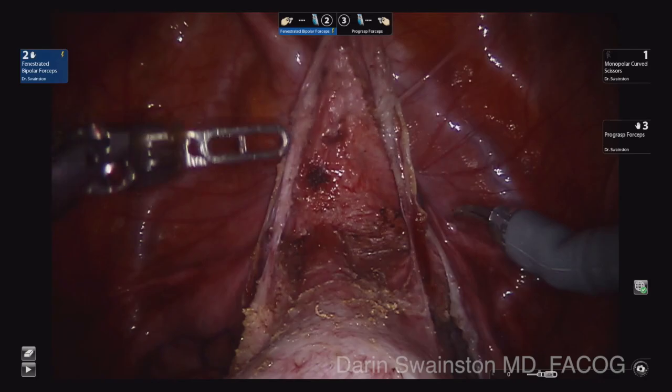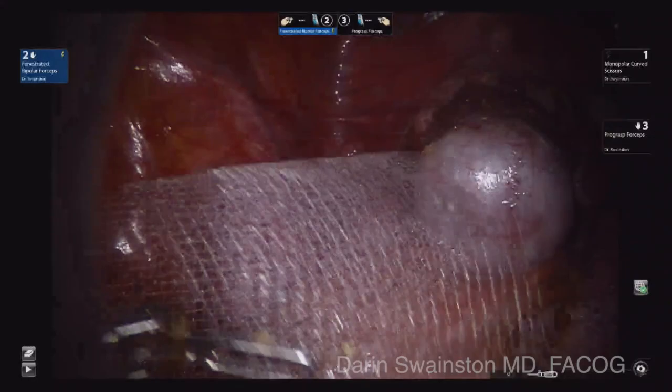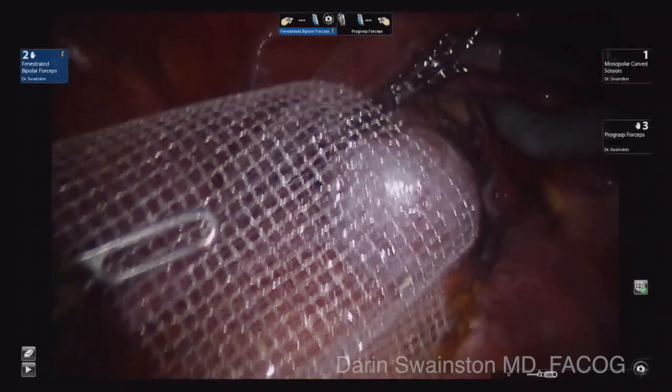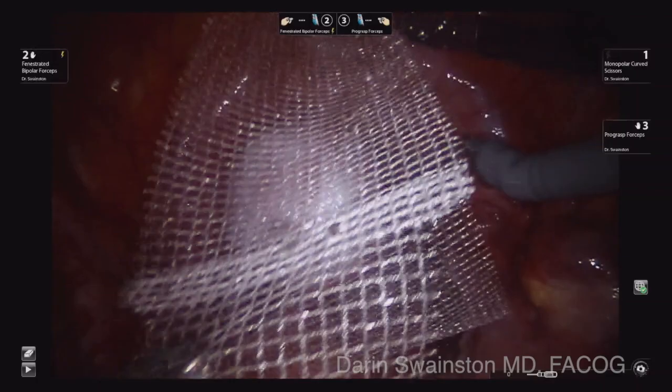This whole dissection really did not take a lot of time — probably less than 15 minutes — and that is how it should be. Now I like bringing in the mesh without rolling it. I like to get an idea of exactly where to place it. The smaller thin arm goes to the sacrum and the fatter part of the mesh goes around the vagina, both anterior and posterior. So I am positioning that in place and I don't trim it right away.